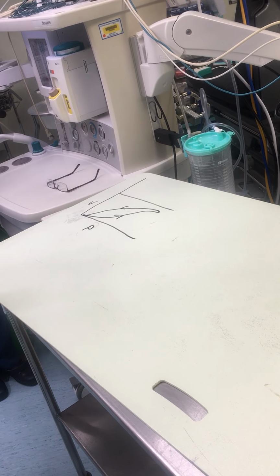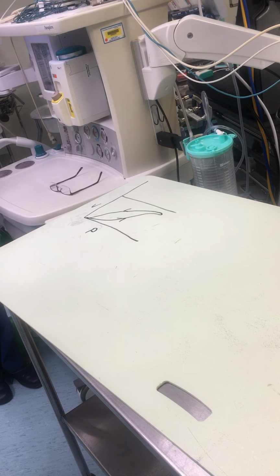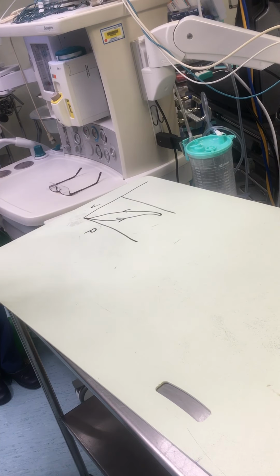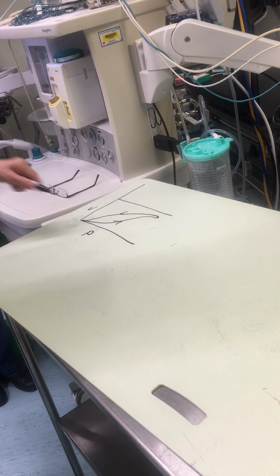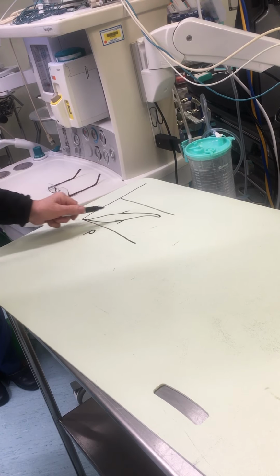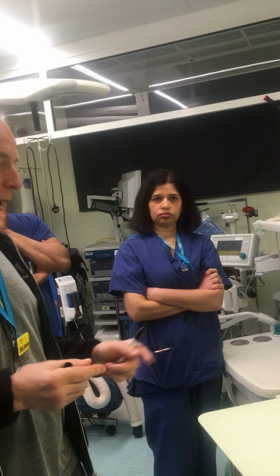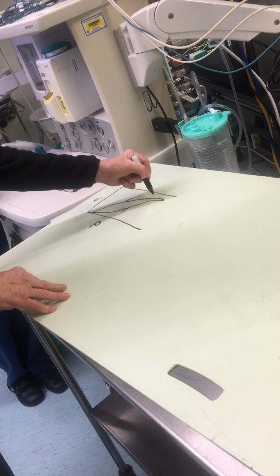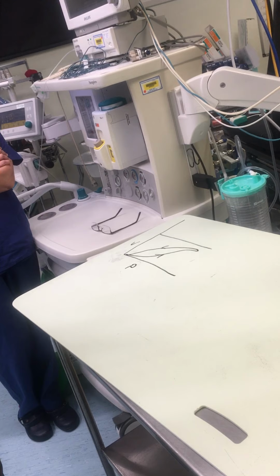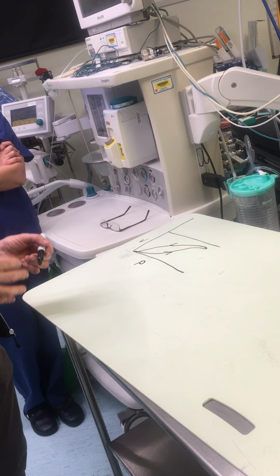The way to think about that is like blowing up a balloon. When you start off blowing up a balloon, you go red, so the pressure goes up, but the volume doesn't change, and then all of a sudden it goes, and it becomes much easier. So you get a steep rise, much more volume change for less pressure. And then at the top, you've gone red, everyone's going, because the balloon's really tight. That's up here, where you've got what's called the upper inflection point. And then when you let the balloon down, the volume is bigger for the same pressure all the way down. Okay? So that's what we're doing.